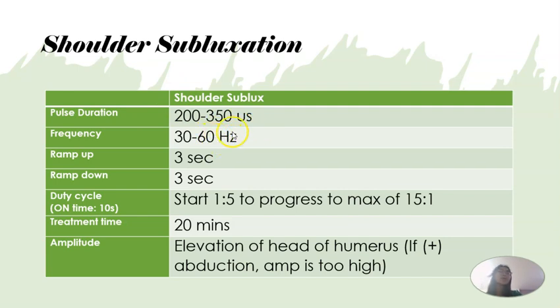If the unit is in hertz, then obviously you are adjusting the frequency or pulse rate. If the blinking one is in microseconds, more likely you're adjusting the pulse duration or pulse width.